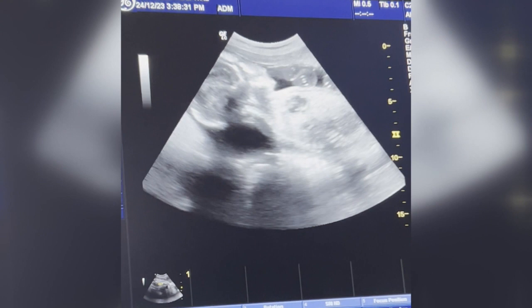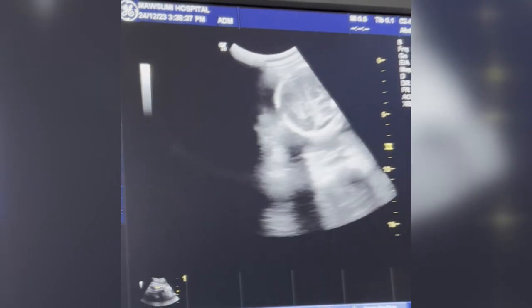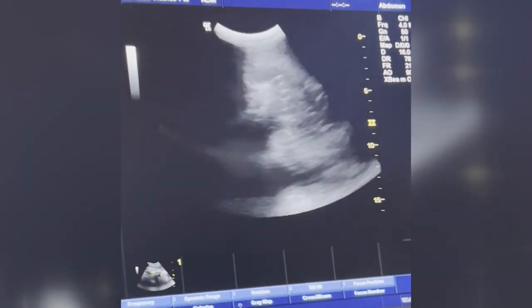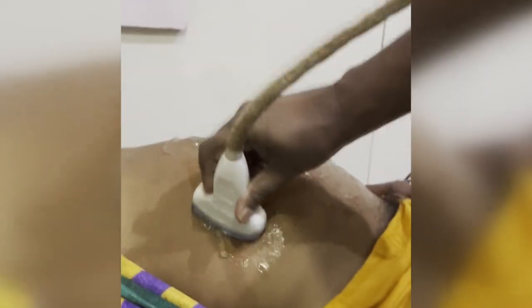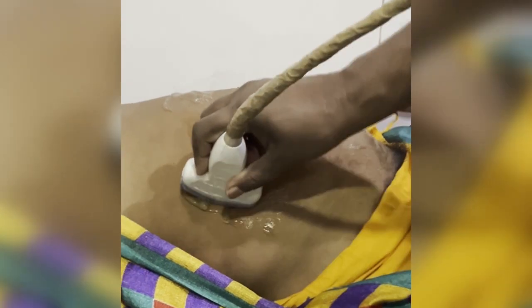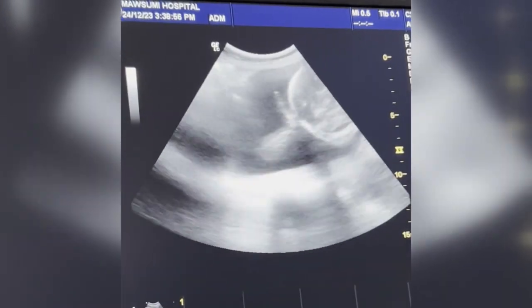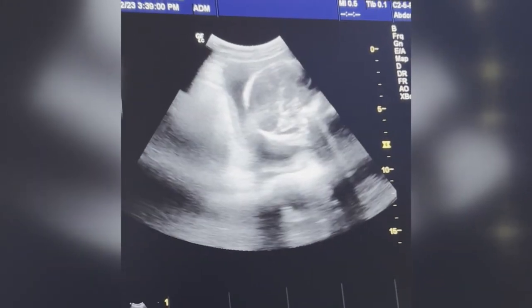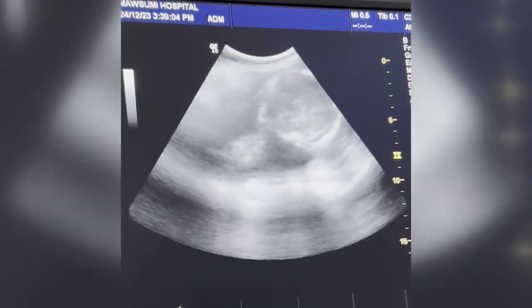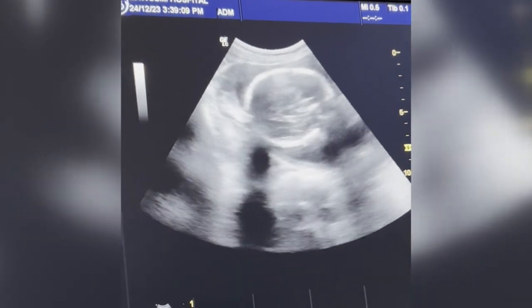Heart is, see? Heart is palpitating. Now, we shall go for the head measurement. Head is in this side. See? Here. Head should be down, then it is normal, but it would rotate. Very early to say, head would be in this side.